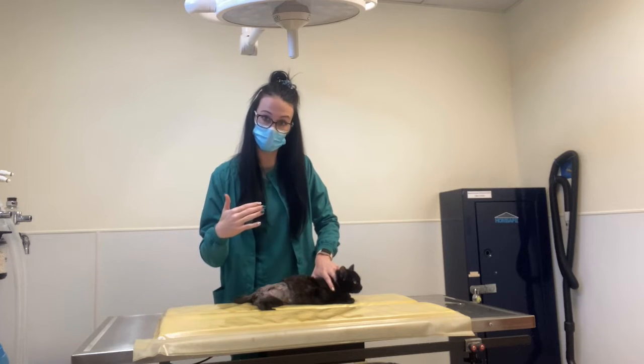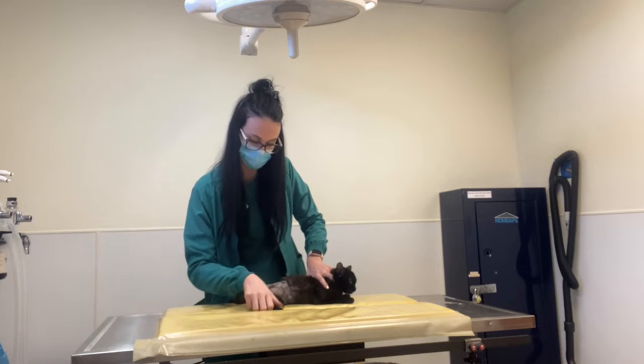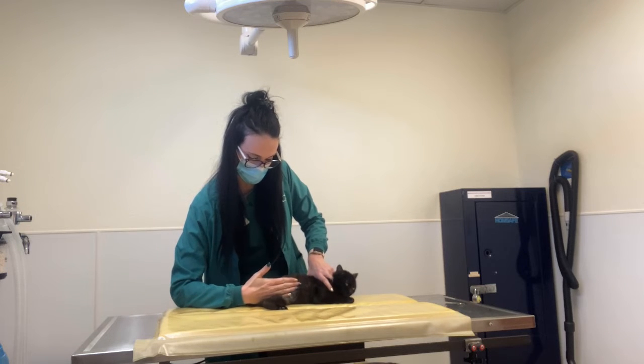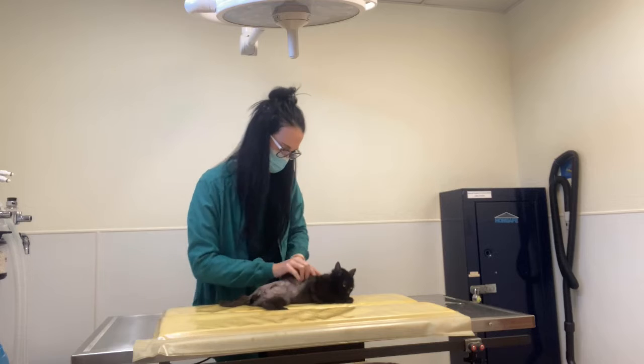So if she had her leg, I would just pick this leg up, and then the other technician extends this bottom leg out, and then I just hold off here, apply pressure, and that'll pop that vein out so the other technician can draw.